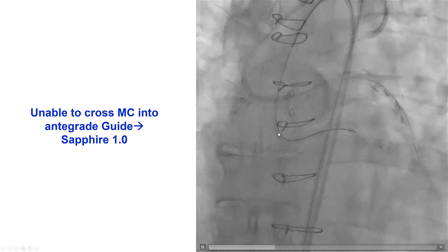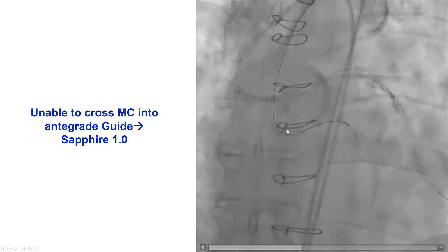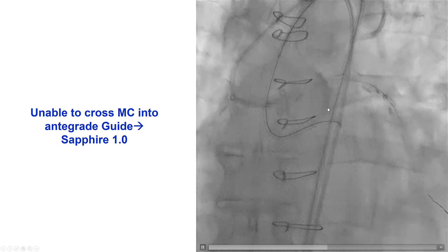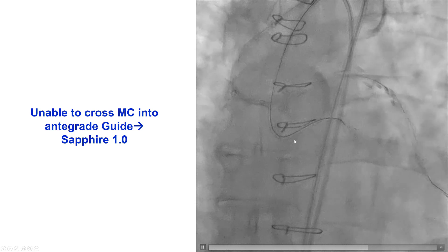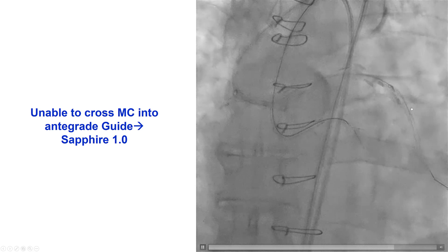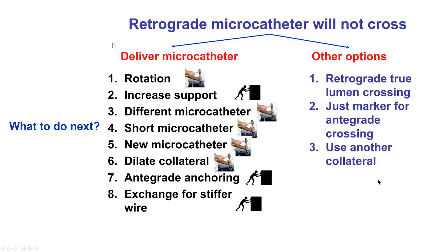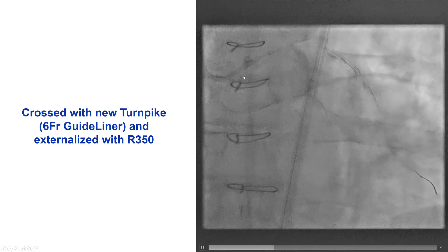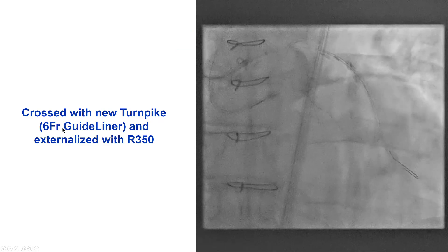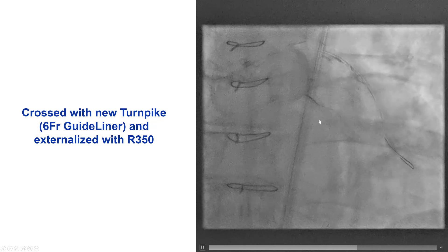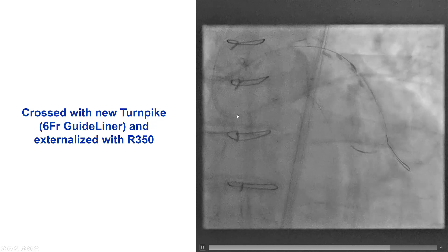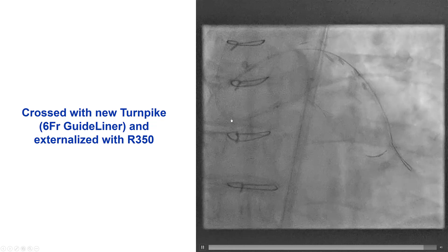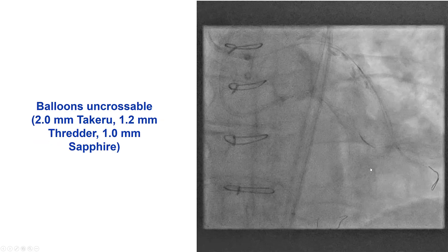We went back and did an attempt to cross retrograde using a Gaia Second guide wire, and this time the wire actually successfully crossed into the proximal true lumen and into the antegrade guide catheter. We performed anchoring of the retrograde guide wire, but then we could not get the retrograde microcatheter to come all the way into the antegrade guide catheter. We used a retrograde Sapphire balloon and then a new Turnpike microcatheter with extra support from a six French GuideLiner through the saphenous vein graft. We were able to advance it all the way into the antegrade guide catheter and then externalize an R350.